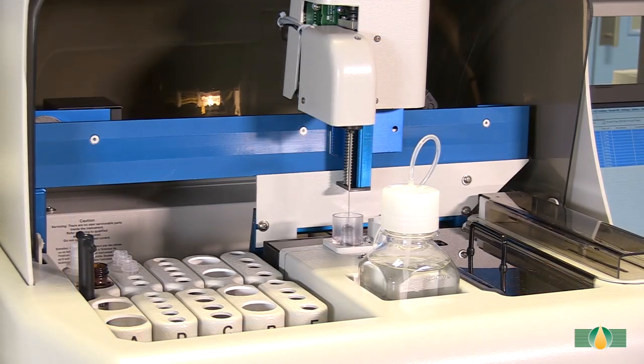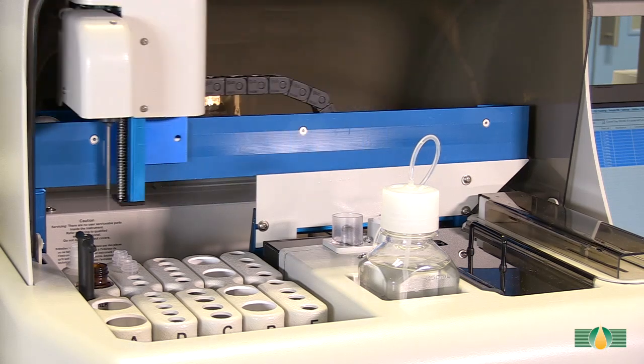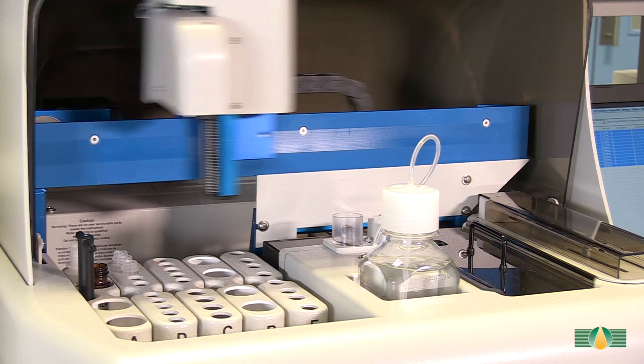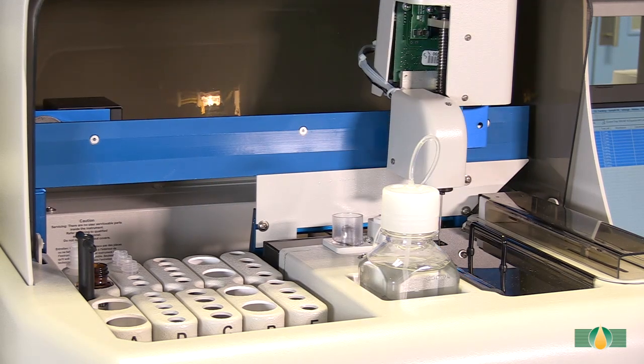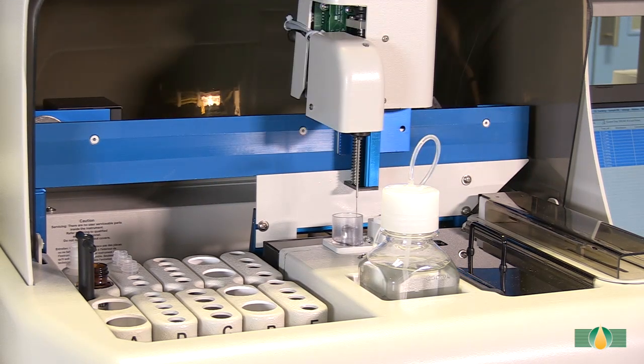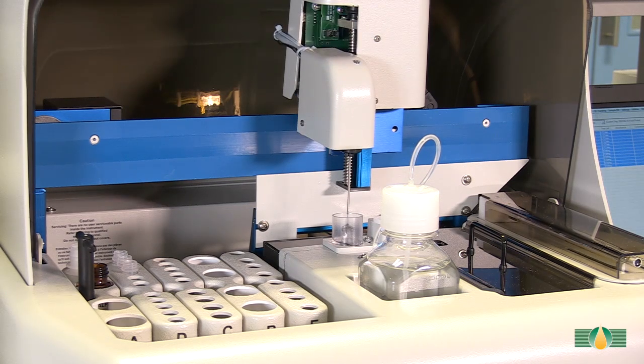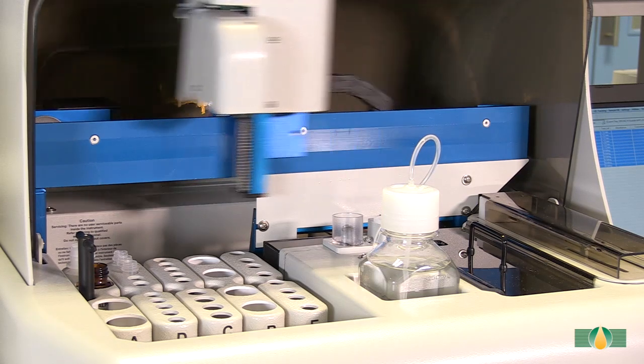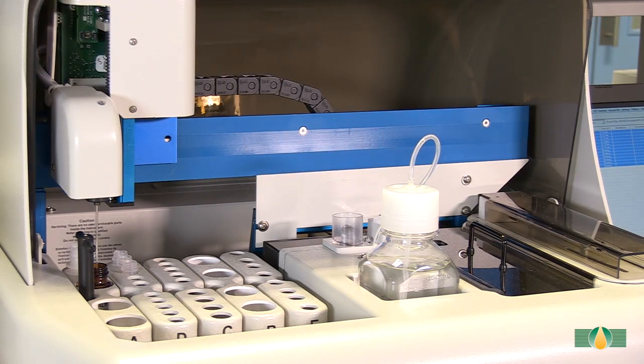In this automated alpha-amylase assay procedure, 20 microliters of malt extract sample is added to 20 microliters of Ceralpha reagent, then mixed, followed by incubation for 10 minutes. Reactions are terminated by the addition of 300 microliters of stopping reagent, and the absorbance is read at 405 nanometers.